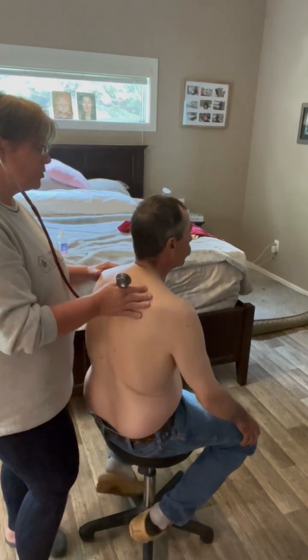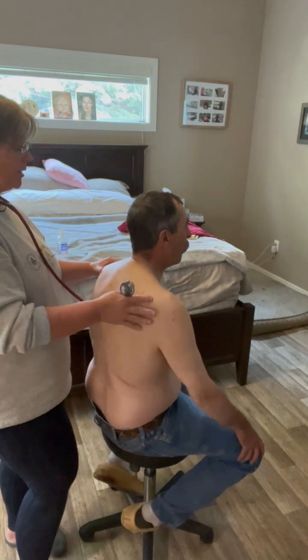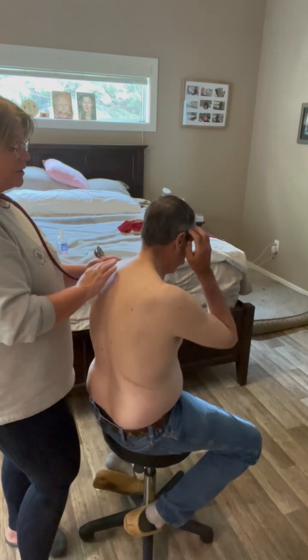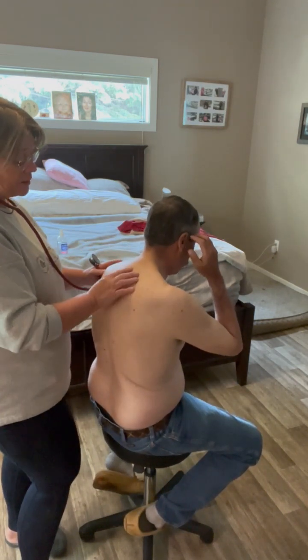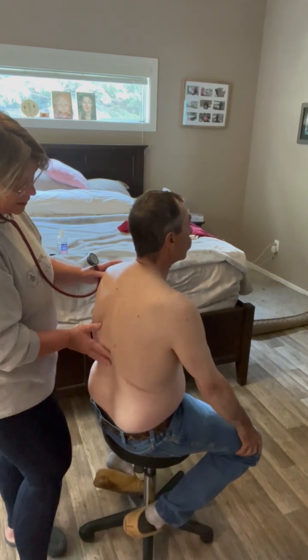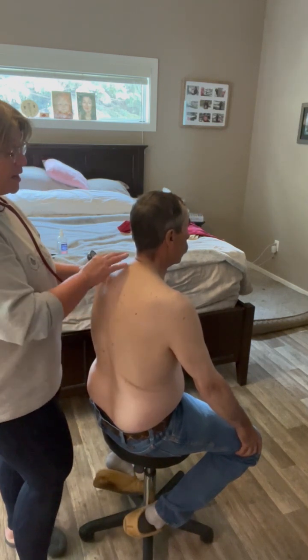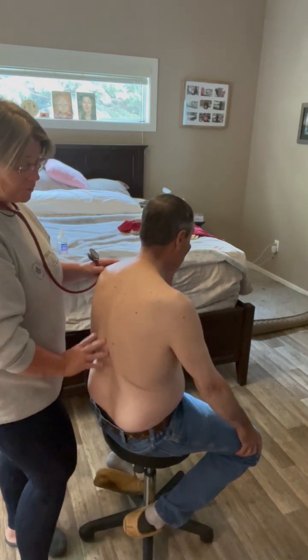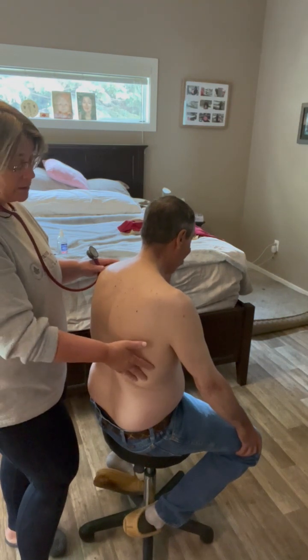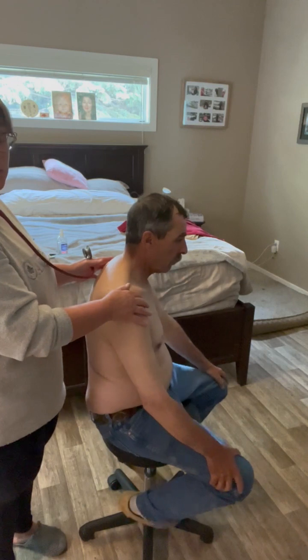Great. Thank you very much. You can breathe normally. So when I listen to your chest, don't turn yet. When I listen to your chest, I hear vesicular breath sounds. I hear bronchovesicular breath sounds in between the scapula and vesicular breath sounds throughout all the lung fields. I hear good air entry throughout the lung fields, all the way to the bases of the lung fields. They're nice and clear, no adventitious sounds, no wheezes, rubs, or rales.